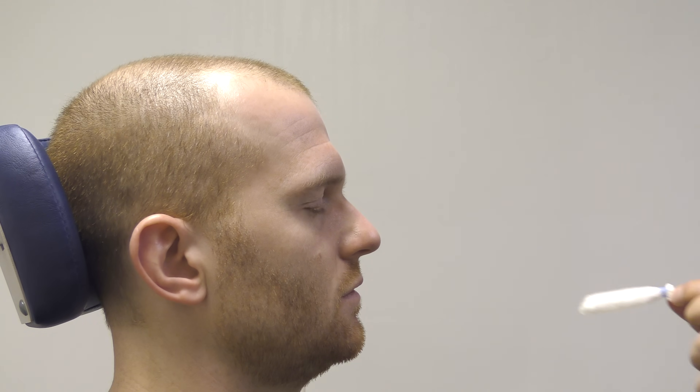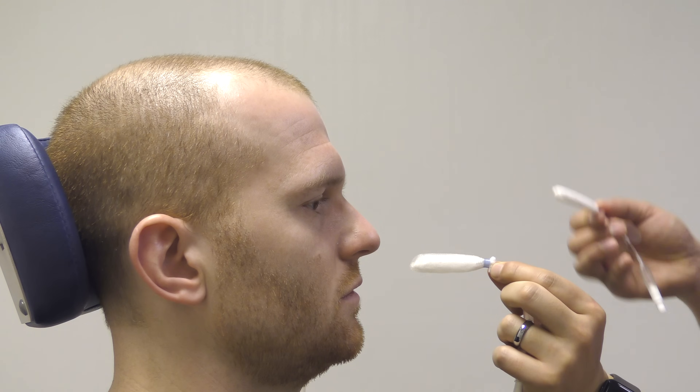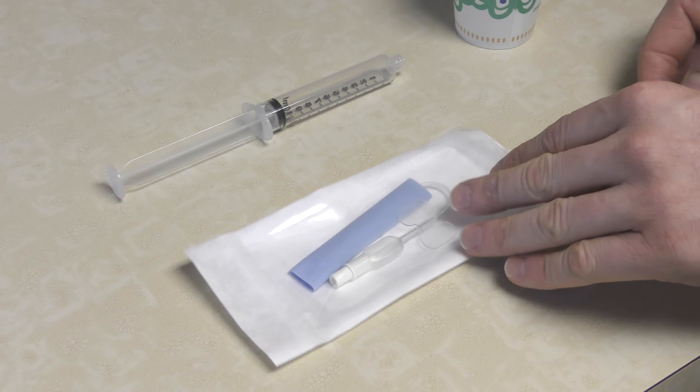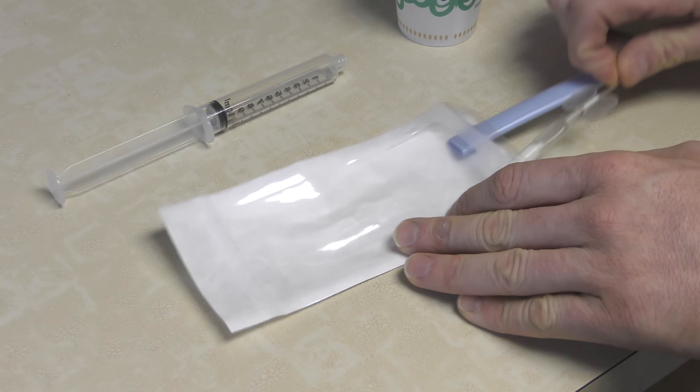With a severe nosebleed, nasal packing is required for control. A small nasal pack is used for anterior nosebleeds, whereas a much longer nasal pack is used for nosebleeds deep inside the nose. In this case, placement of a small nasal pack will be demonstrated.